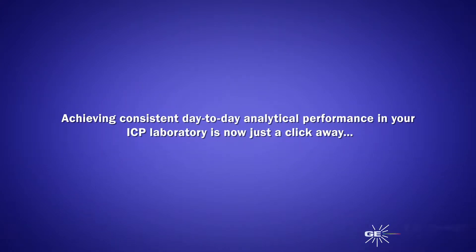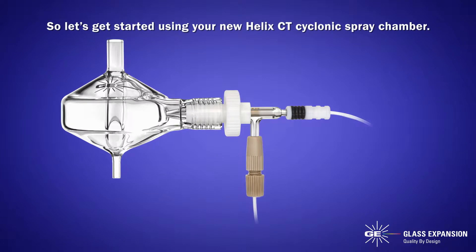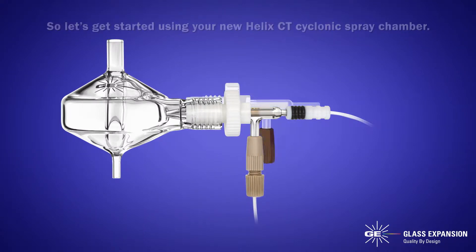Achieving consistent day-to-day analytical performance in your ICP laboratory is now just a click away. Let's get started using your new Helix CT cyclonic spray chamber.